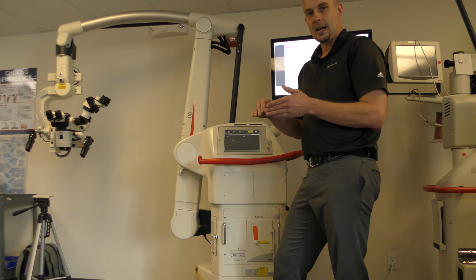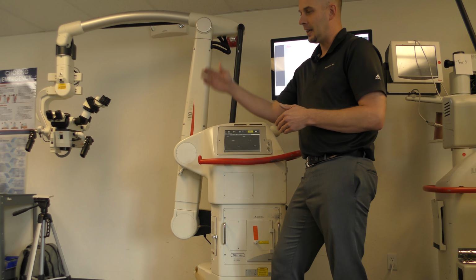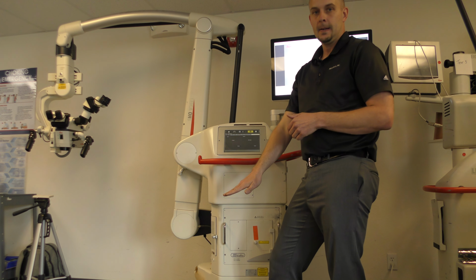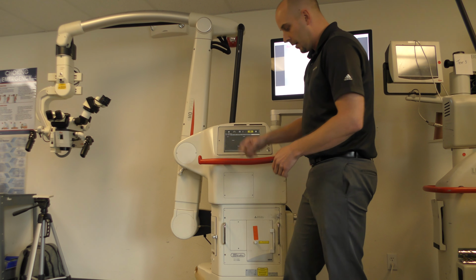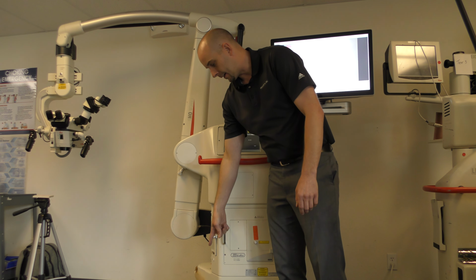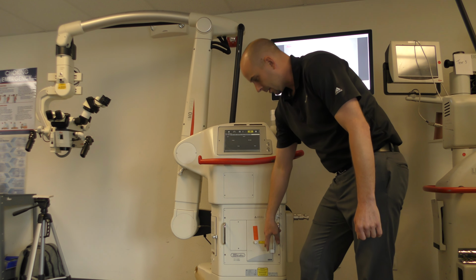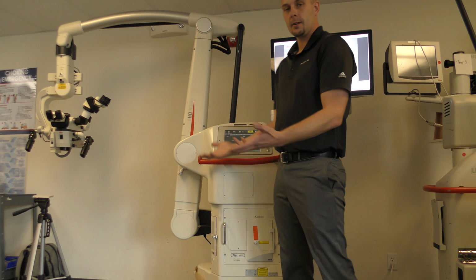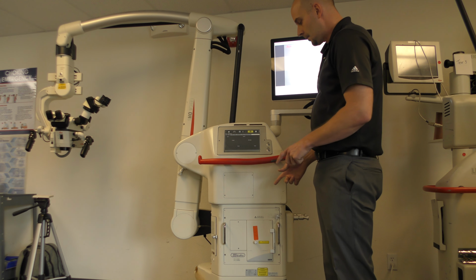Right? And then right after that, I follow up and say, these bulbs need to be replaced, see below for pricing. And it immediately lands in the line items of the parts. So now we have $1,200 for the brake replacement, we have $1,350 on both these bulbs. So now your PM went from $145 to upwards of $6,000, right?